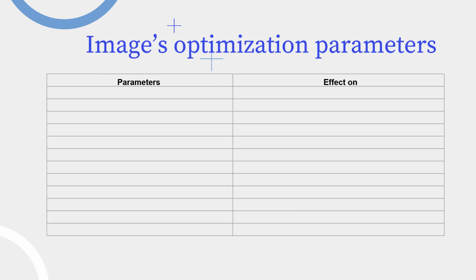Each image could be improved in order to fit the goal of the ultrasound application. In the table below, you could find some parameters which are used to optimize these images. First, let's talk about the transmission power, which regulates the amount of energy exciting the crystal, and therefore the strength of the ultrasound beam. By increasing it, we will increase the depth penetration and so the exposure. So, we will set it to respect the ALARA rule. Depth of field also plays a prominent part in ultrasound application.